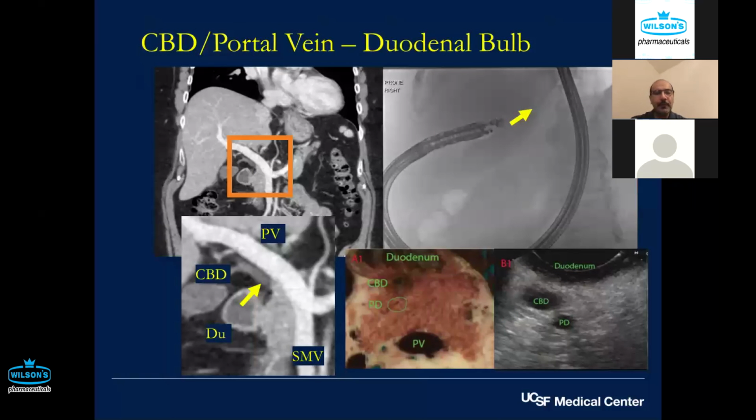Now, when you go from the stomach into the duodenum, if you look at the fluoroscopic position, this is like your long position in the bulb when we are treating peptic ulcers, or in the ERCP scope, or before we reduce. You're actually making a big loop in the stomach, pointing upwards. So if this is your duodenum, your probe is actually here, and it's going to point up. And I zoom in here.